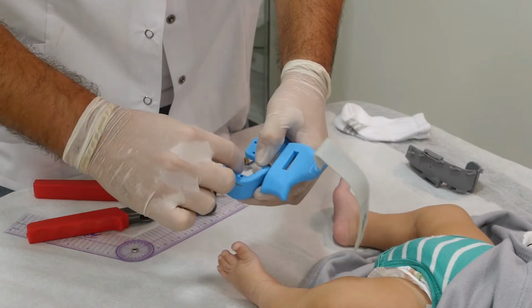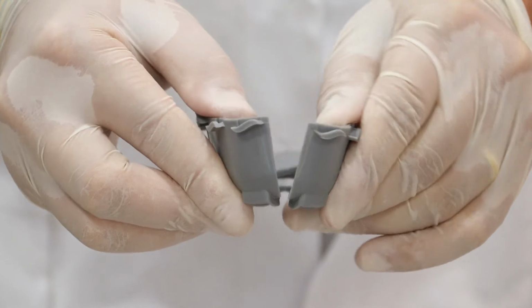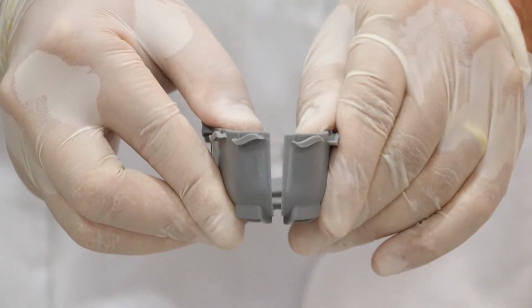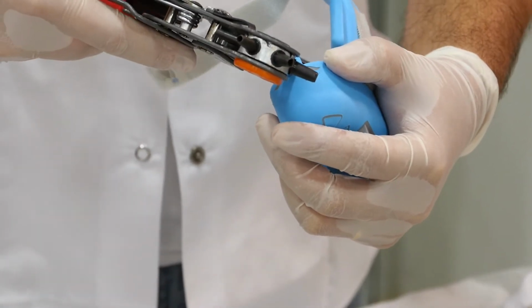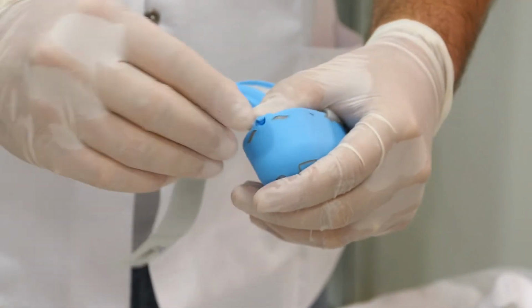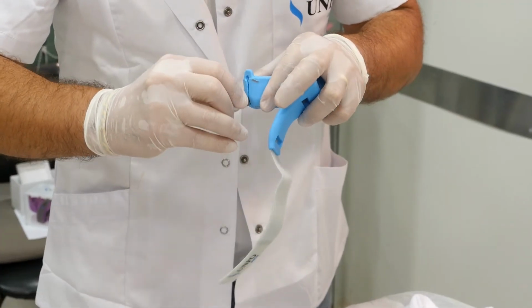First adjustment would be the enlargement of the ankle area. The back side of the inner part of the Unfo brace is bisected to release pressure from the ankle area, in case the baby's foot is wide or large in the back. The enlargement is performed by making a hole in the designated area and making a cut all along to the bottom of the ankle.